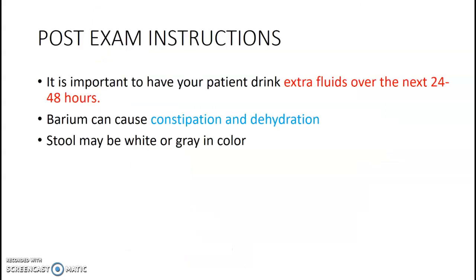And post-exam instructions. Anytime you give a patient barium, you want to make sure and give them some post-exam instructions. So have your patient drink extra fluids the next 24 to 48 hours. Barium can cause constipation and dehydration. Their stool is also probably going to be white or gray in color, depending on how much they drank. Giving your patient a heads up on this is important so they don't panic if these things happen.